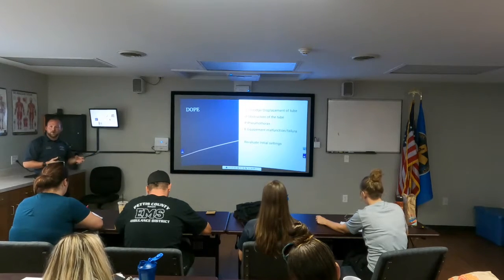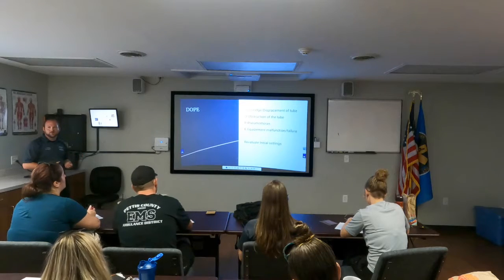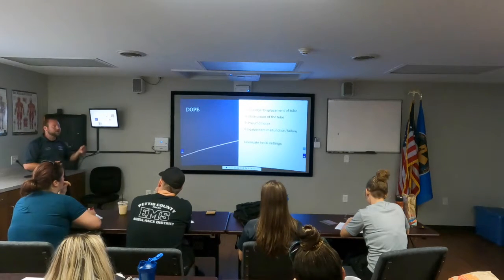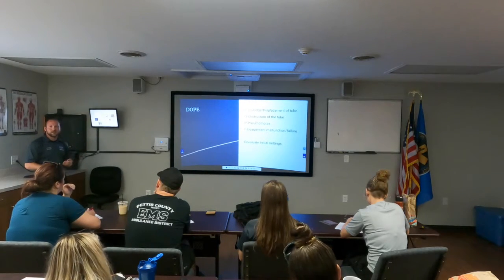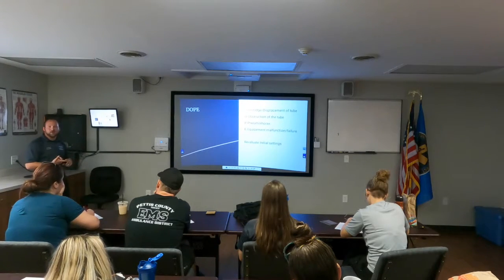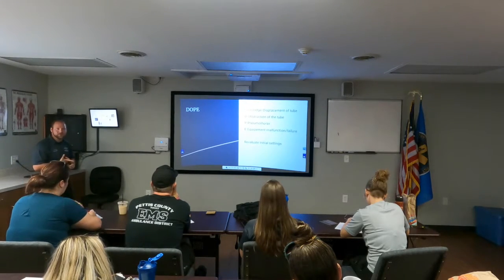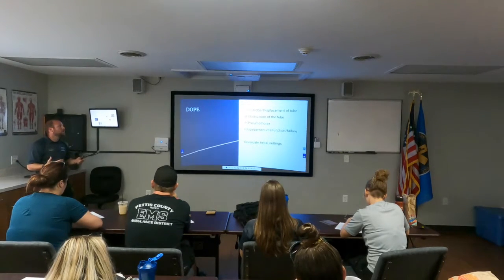If you're running into issues where your alarms are going off, see what those alarms are telling you and start from there. Start with where it's connected to the patient. See if we have any displacement or dislodgement. See if it was even secured properly before you left, or has it moved during your transfer at all.